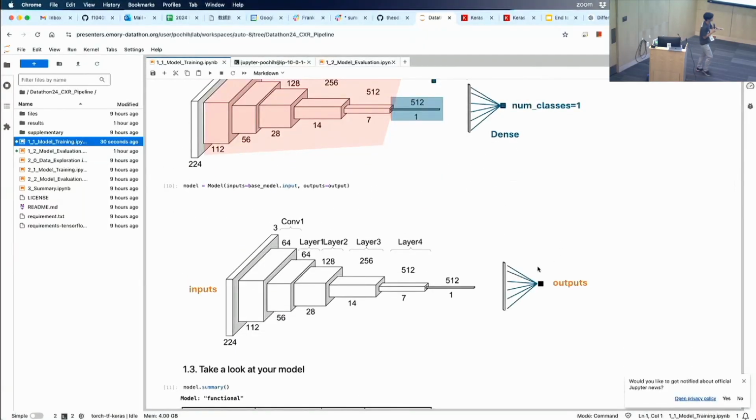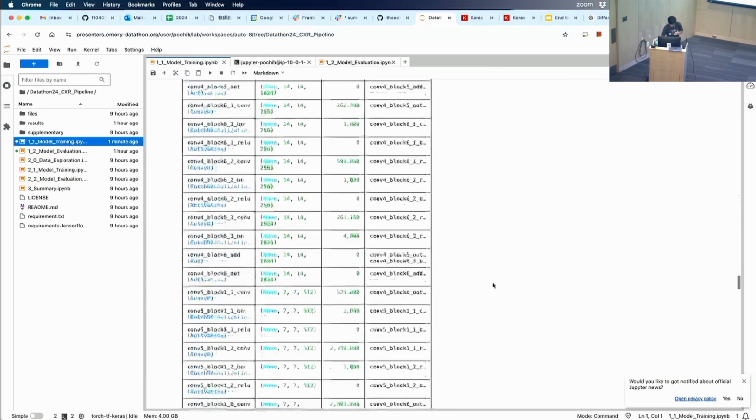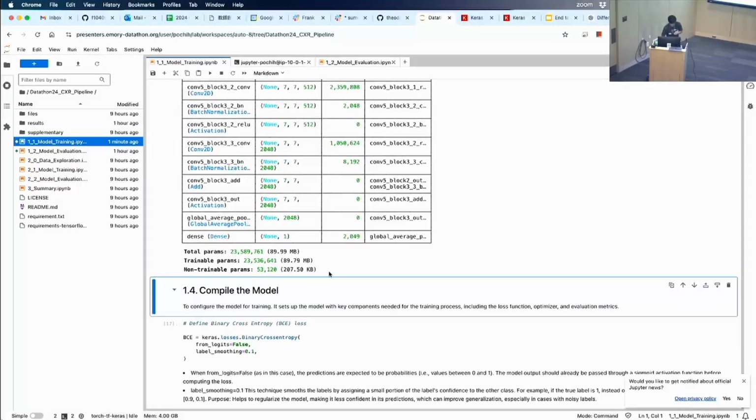The reason is we are going to create a single output from the 2048 values, so we connect each element to our output. The number of parameters equals the number of lines here. This is a 2000 vector, so we will have 2000 lines, and those lines are the parameters we are going to train. So you can see the total number of parameters is quite huge.